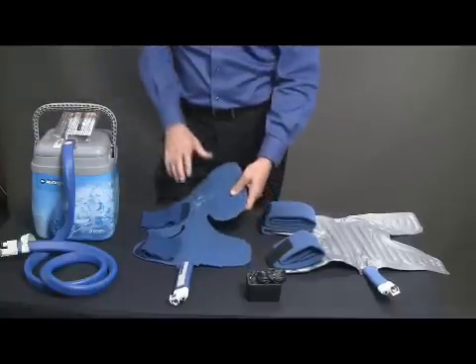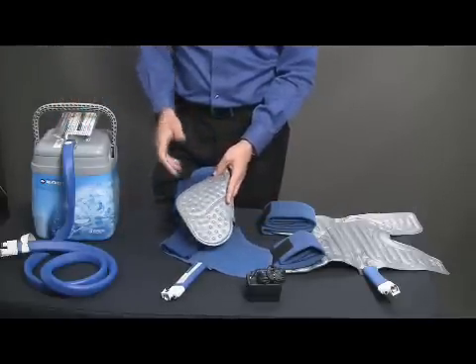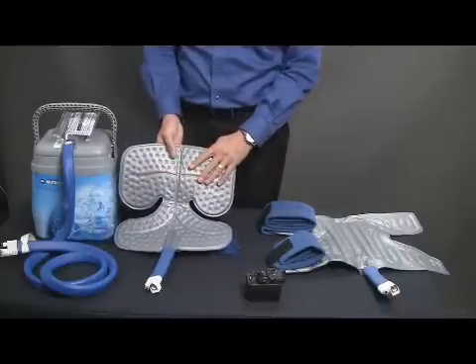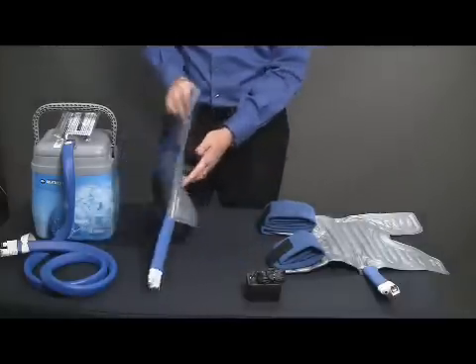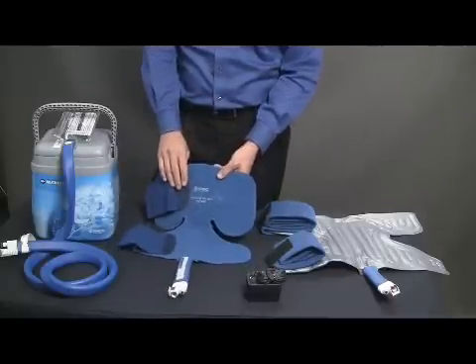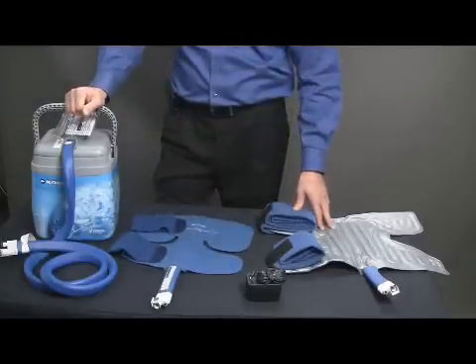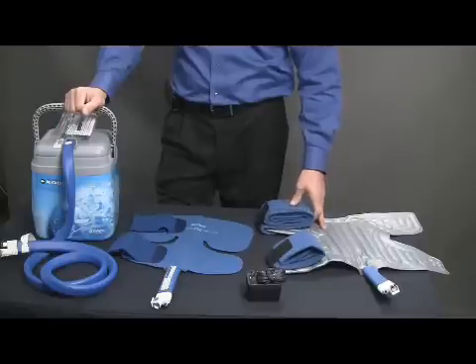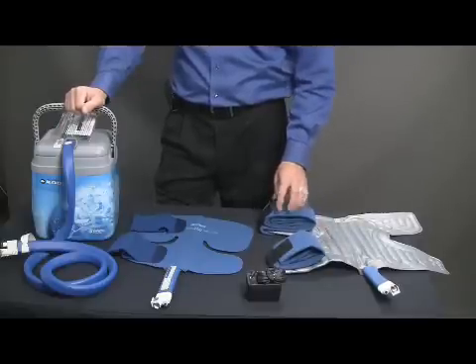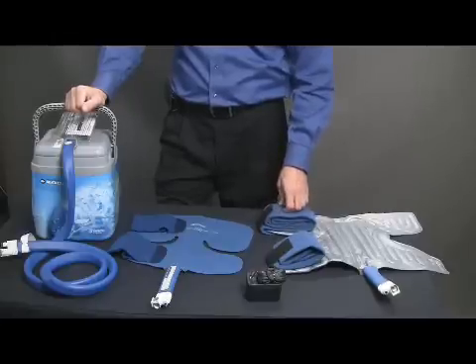When using any cold therapy device, whether it's the Breg cold therapy, Kodiak, or any others, we want to make sure that this pad is not placed directly on the skin, that there's some type of barrier, whether it's web roll or a thin shirt or your bandaging, something that sits between the pad and the skin so as to protect that skin from any type of cold damage. And that's really why those risk factors are there. We want to make sure that those who are using it are able to communicate well as they're using it to any irritation they might be experiencing while using continuous cold therapy.